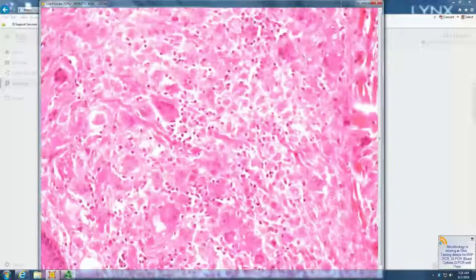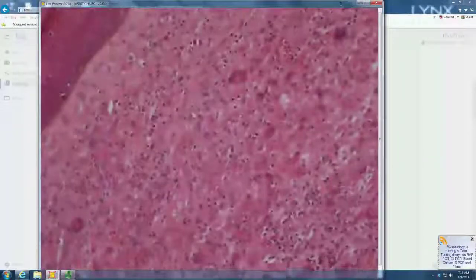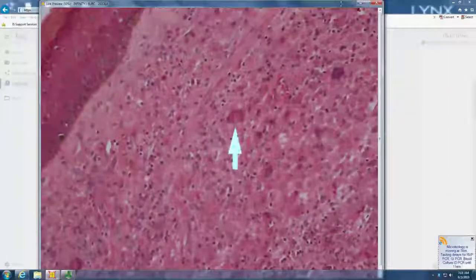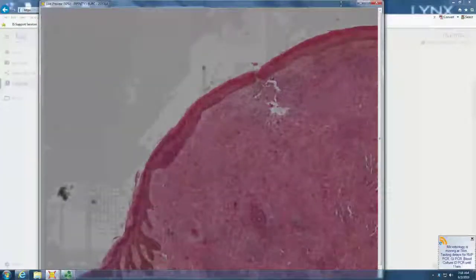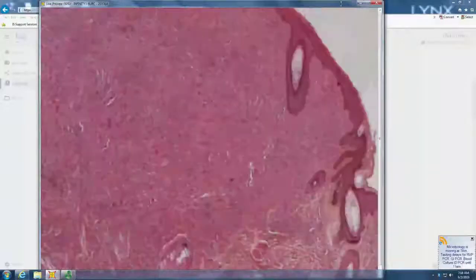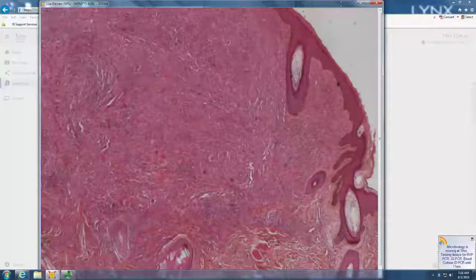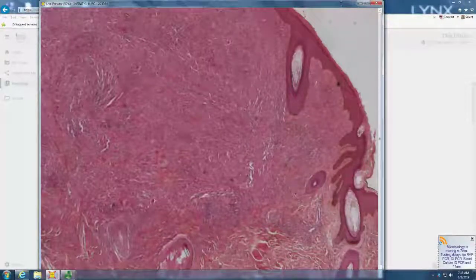So certainly a histiocytic infiltrate. Yeah, many Touton giant cells. So xanthogranuloma, very good. So xanthogranuloma, or if the child is juvenile xanthogranuloma. So it's a JXG unless the patient's not J, in which case it's just an XG.